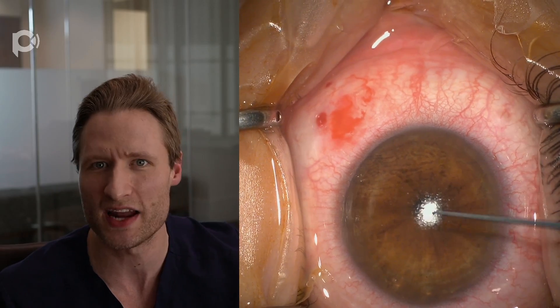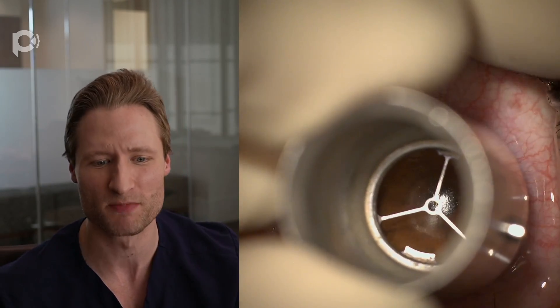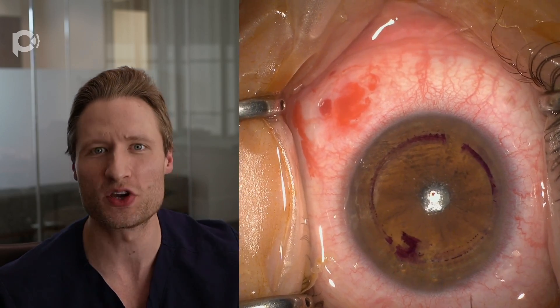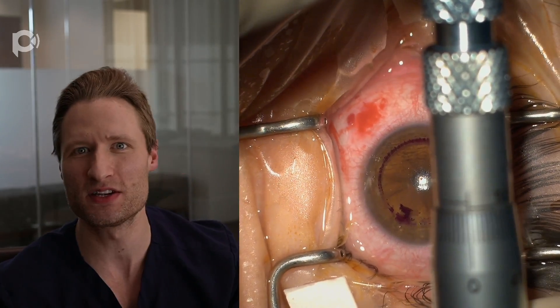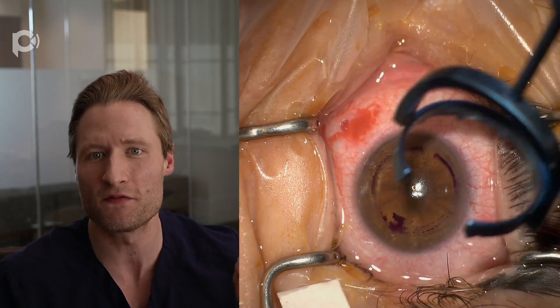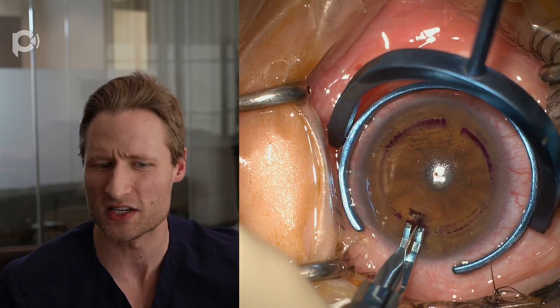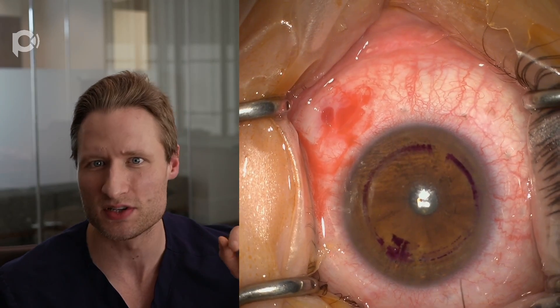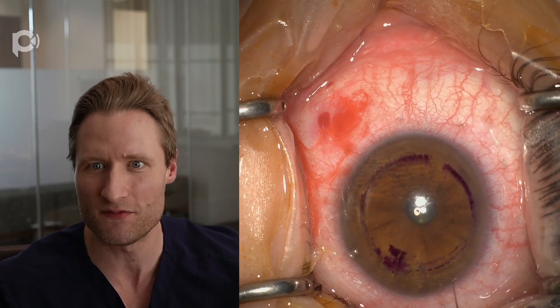This is a zone marker I'm using to make an epithelial impression, and I'm dotting the center of that impression with a Gentian Violet-inked Senske hook. This is a corneal marker also inked with Gentian Violet, and I'm placing it on the eye to outline the location of my incision and where my corneal channel will be. This is a guarded diamond micrometer knife, and I'm setting the incisional depth to 70% of the measured Pentacam thickness of the cornea at the planned incision location — here at about 10 o'clock on a right eye. I calculate 70% of that depth, set the diamond knife accordingly, and make a simple one-millimeter radial groove.